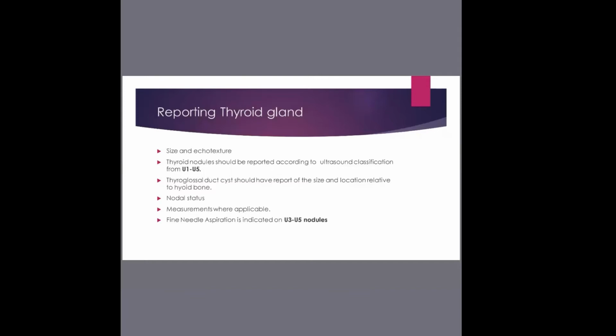These are things we've seen, and you need to have differentials. As a matter of fact, if you're practicing ultrasound, differentials should be something you yearn to know at your fingertips, because what we may see and you think this is it may not be. So you need to have that differential diagnosis in your head as you're scanning. And then comment if appearances are atypical or not in keeping with clinical questions, and offer explanations where possible.